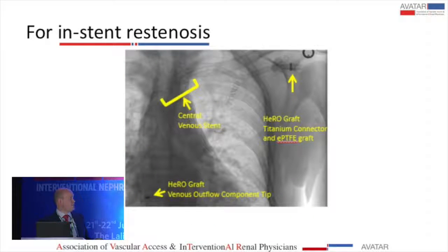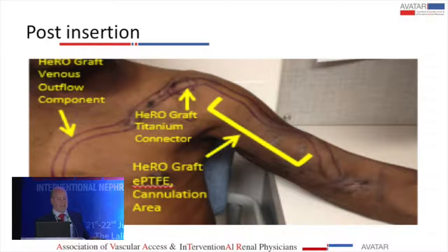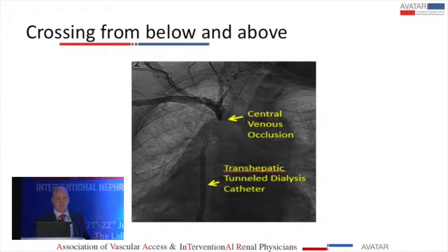The company have recently introduced this. This is an adapter to fit it to your early cannulation graft. And really these people are people who are running out of access, and often you'll want to cannulate this early in that type of person if it's an option. Basically what you do is you get your Gore Acuseal or your Atrium Flixene, and you slide it onto there, and then this bit snaps shut over the top, and then you push that into the venous outflow component, which saves you having to do an extra anastomosis, which is what people were doing previously. But that's about 150 pounds, whatever that is in rupees, like a couple of thousand rupees just for the connector.